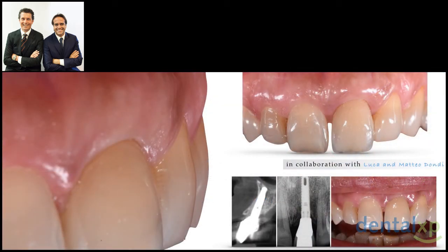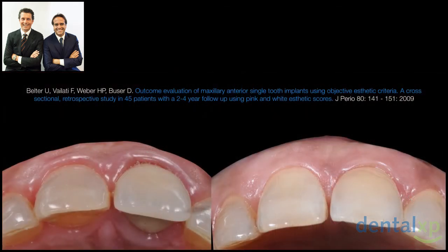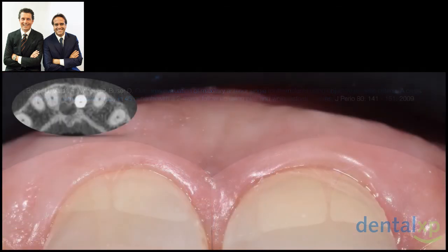Look at the CBCT evaluation, look at the X-ray evaluation. Despite the bone remodeling, we maintain the great volume, the great hard tissue volume. And look also that we maintain the diastema, because the patient wanted to maintain her diastema, but what is more important is the before and after picture, which is our goal in type 1 clinical anatomical scenario, to maintain what we have. And look at this picture, before and after, where if I put this in higher magnification, you are probably able to appreciate better the root profile of number 21 or number 9.